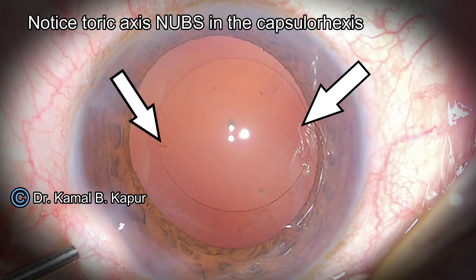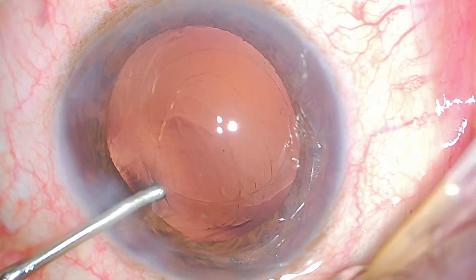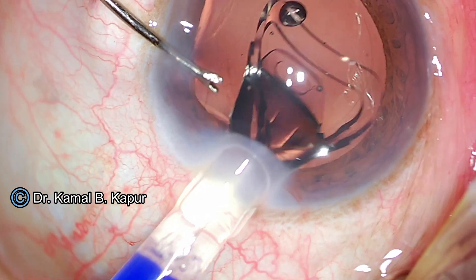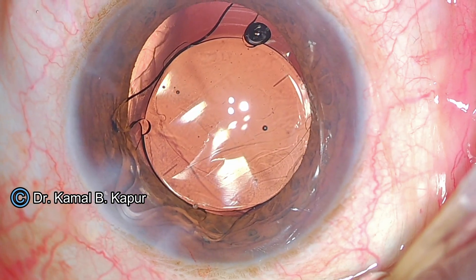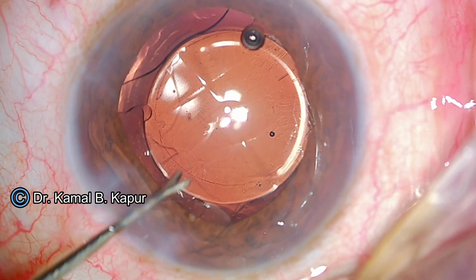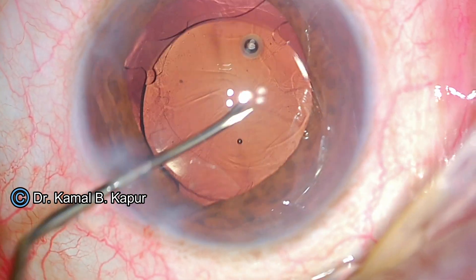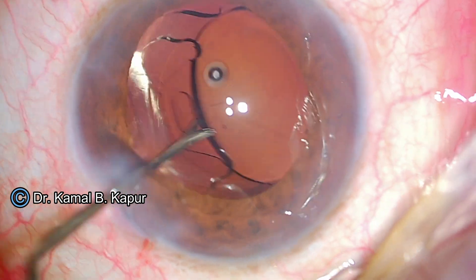These are the two nubs which are marked on the capsular axis — these are called the IntelliAxis. They are made by the Lenzar machine, which is a femtolaser machine. We have done nearly 20,000 surgeries on this machine and it has exceptional results. Once the nubs have been identified, you inject the lens into the bag. You could have two choices: either place the lens with the leading haptics in the bag and trailing haptics out, then remove the viscoelastic and place it, or load the lens directly into the capsular bag as I am doing. You will see that I push in the trailing haptics into the bag.